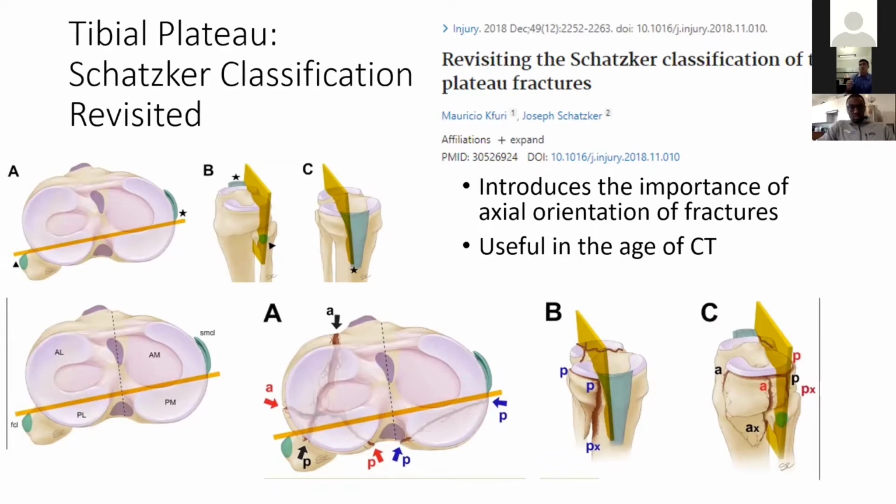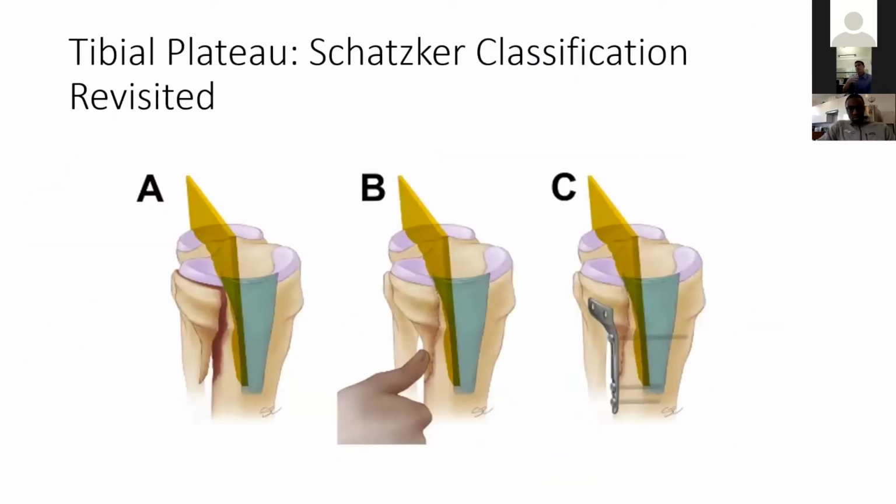And I think you can even simplify that even further and just think about where the metaphyseal apex is. If you look at the bottom right corner here, that AX just means anterior metaphyseal exit, and then PX, you'd have a posterior metaphyseal exit. All of these fancy nomenclature things are saying is, where is the spike? And with that, you're going to do the classic orthopedic thing. You find the spike, you put your thumb on it, and that's your buttress. So it's a really complex way of getting to a concept that all of you already have, and that's how to buttress bone.